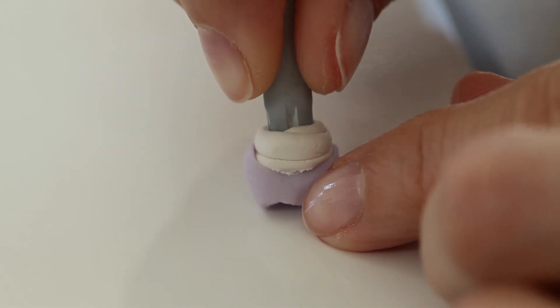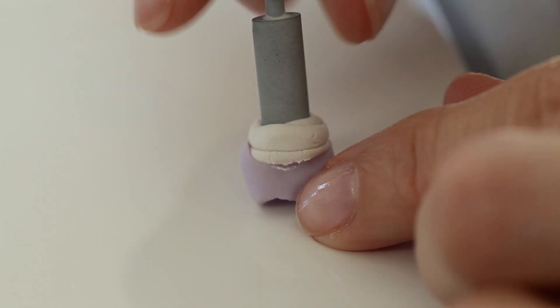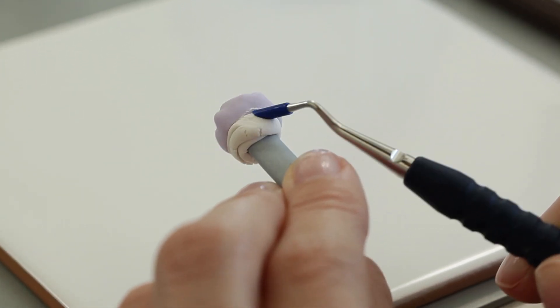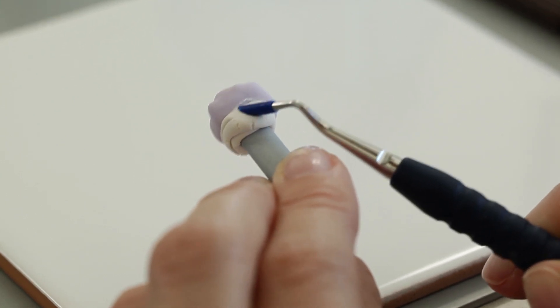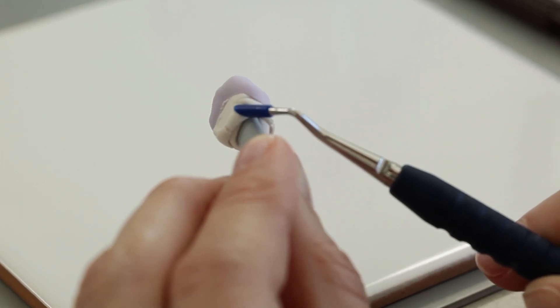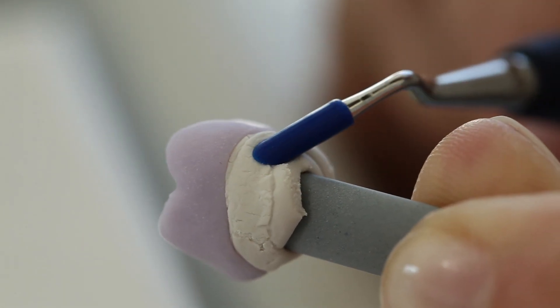Press the IPS Emax CAD crystallization pin deeply into the auxiliary firing paste. Smooth out displaced IPS object fix putty or flow with a plastic spatula from the margin towards the support pin, so that the pin is secured in the paste and the crown margin is supported.